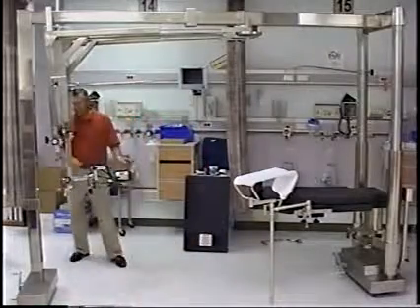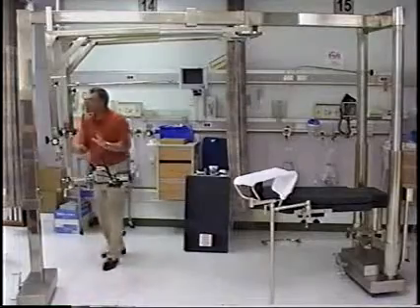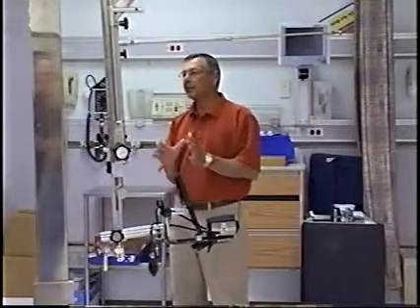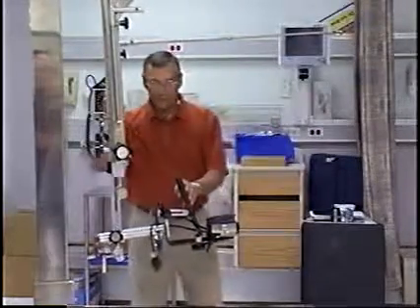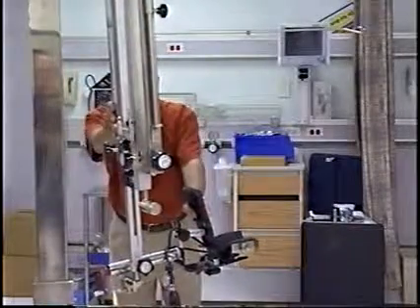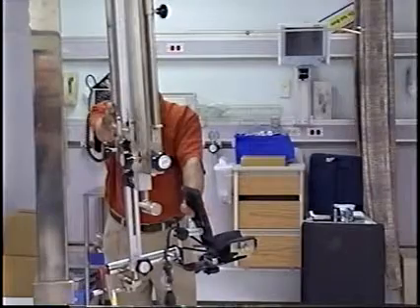So remember, if you're doing a femur, you set it up exactly for a supine femoral rod, exactly like you did for a hip. The only difference is you're going to adduct across midline. That's the only difference for a supine femoral rod.